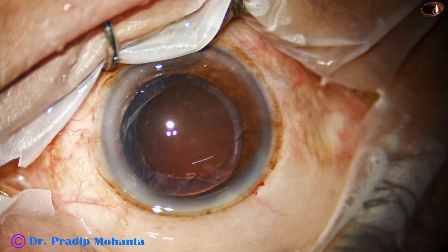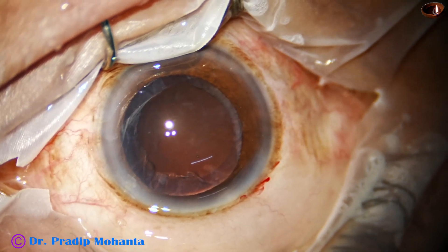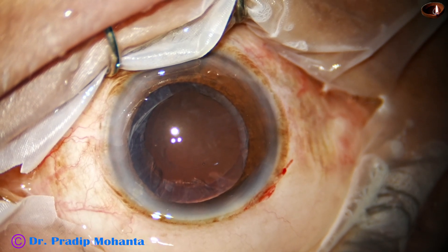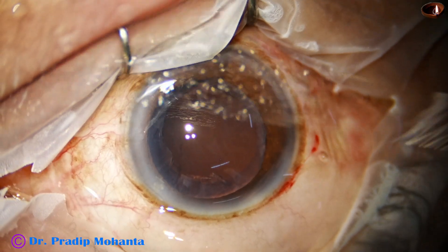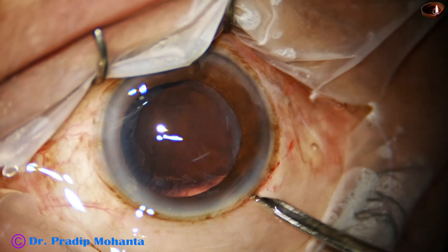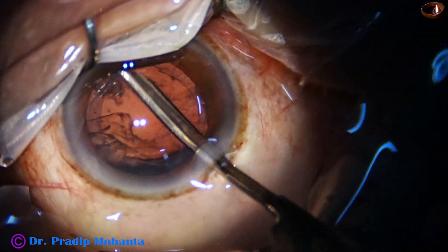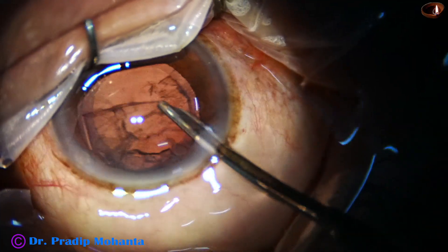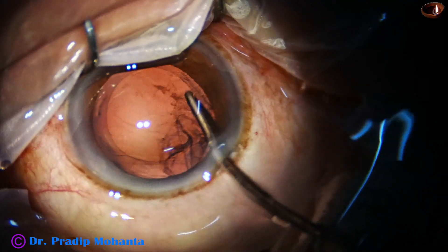Visco again to fill up the capsular bag and the entire chamber. In this case, I am using a 23G Simcoe to remove the cortex. Simcoe is a very safe, very user-friendly instrument. All the control is in your hand, and whenever reflux is needed, you just push the piston. Cortical cleanup is being done and we are almost done.